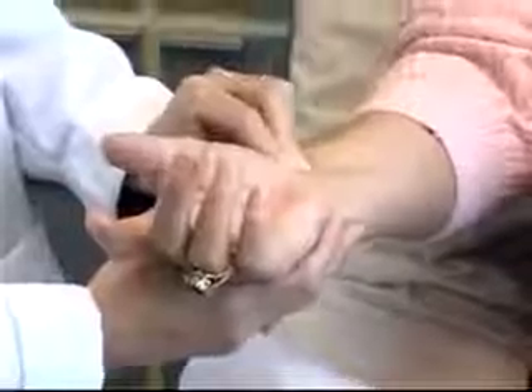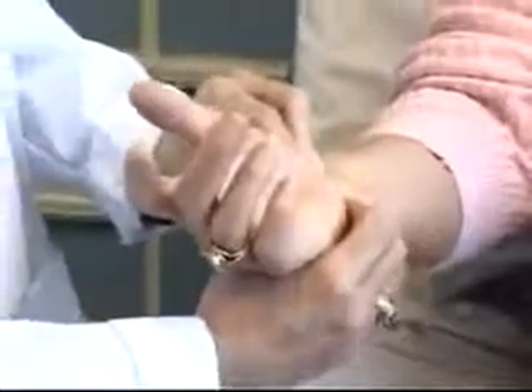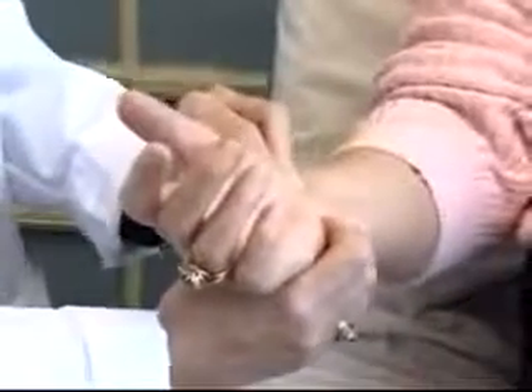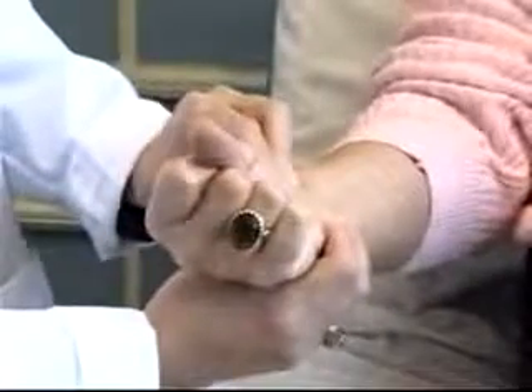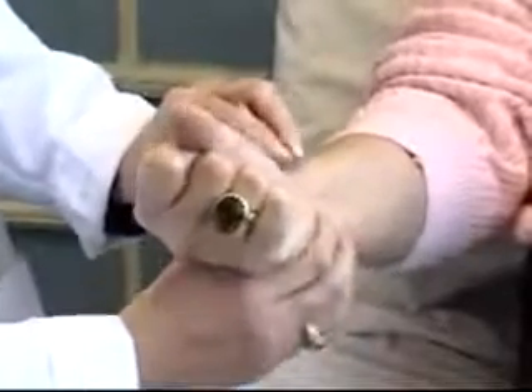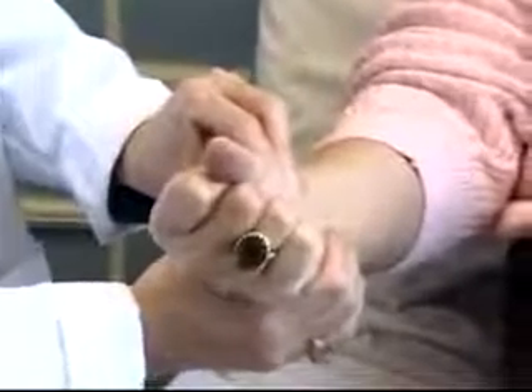The Allen's test is performed as follows. First, I'm going to palpate with my fingers the radial artery. Next, I'm going to palpate the ulnar artery. If I can't feel the ulnar artery, I'm going to palpate the area closest to where I think it would be located. I'm now going to ask my patient to make a fist as tight as she can and maintain that position for approximately 10 seconds, while I occlude both the radial and the ulnar artery.